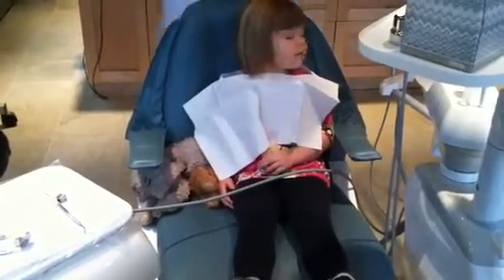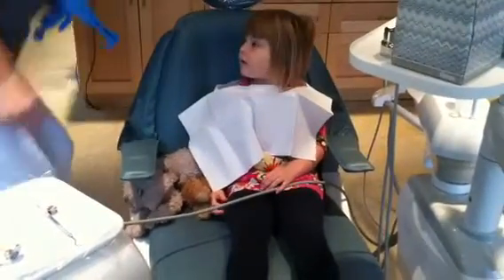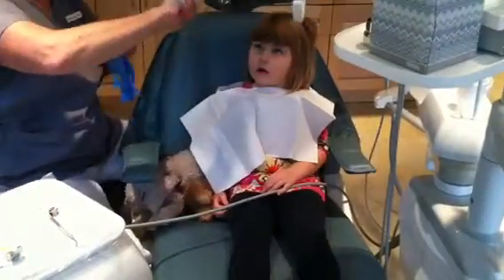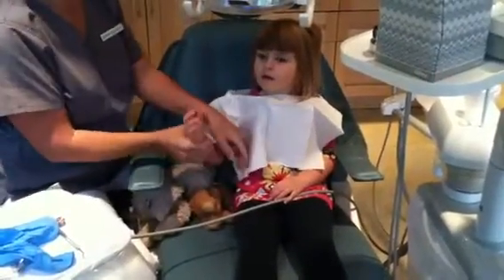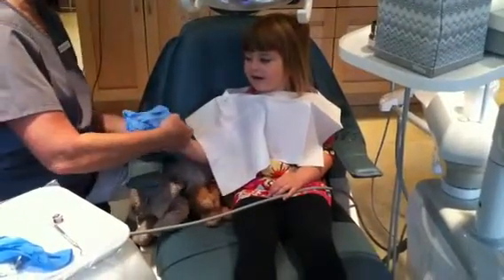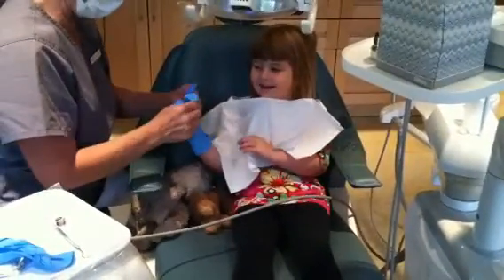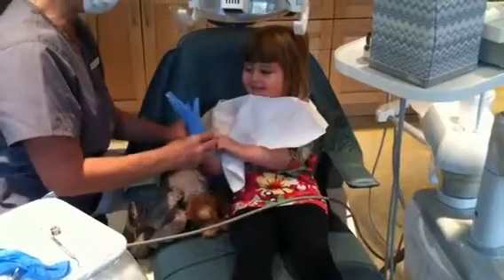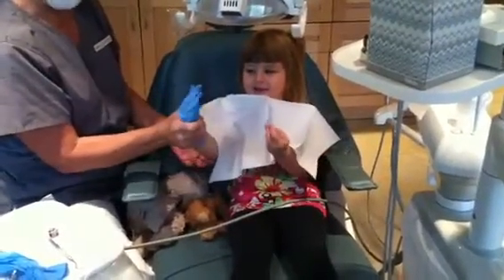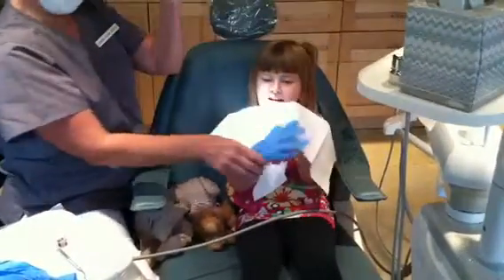I'm going to put the chair back so I can look. Could you turn on my magic light? I'm going to see if you can turn on my magic light. Maybe Joanne will give you a glove to hold too. Oh, you want a glove? Paige loves gloves. You want to put one on? There you go — two fingers. One, two, three, four, five. She's got them all in the right spots. Good job.